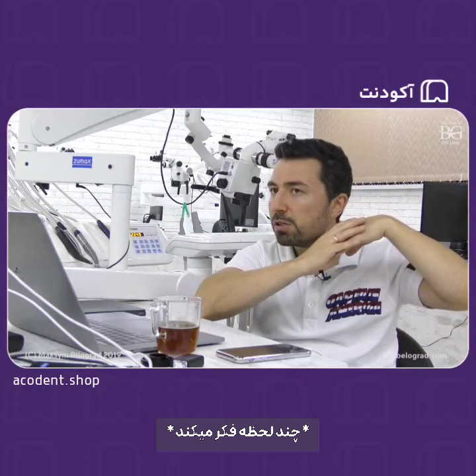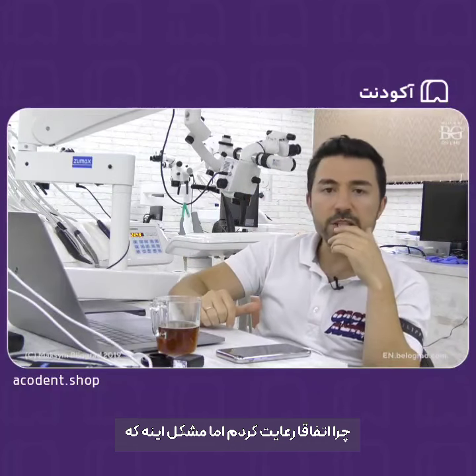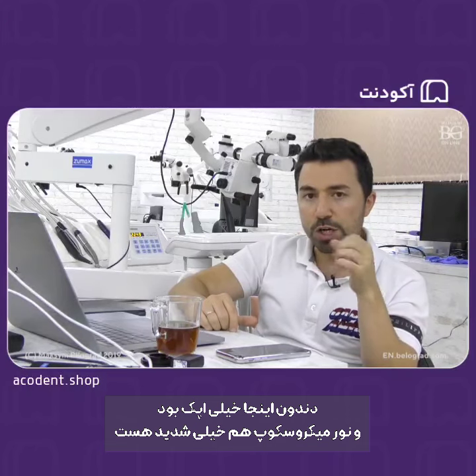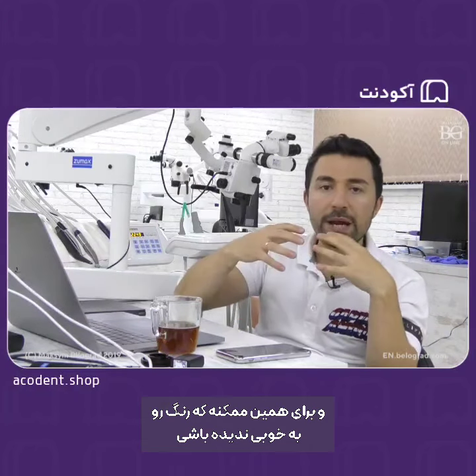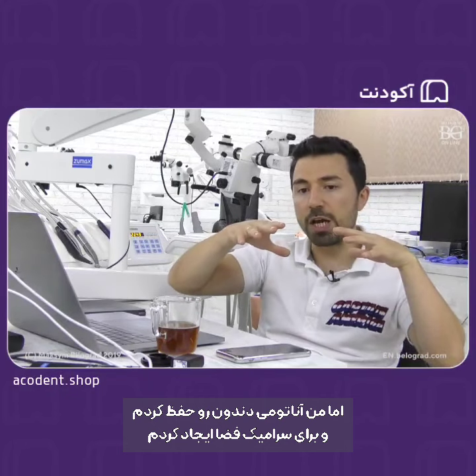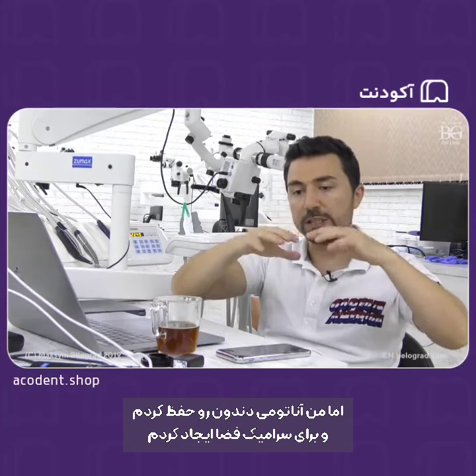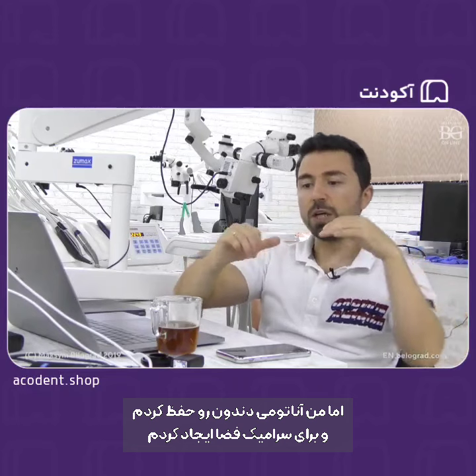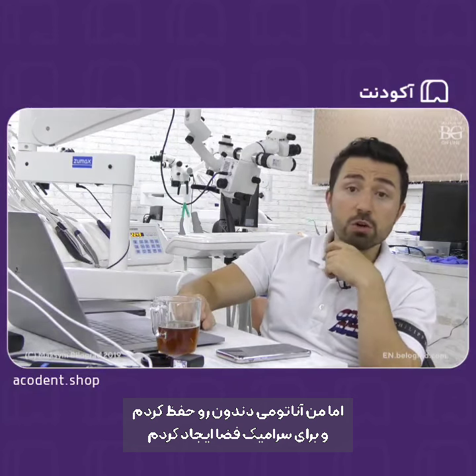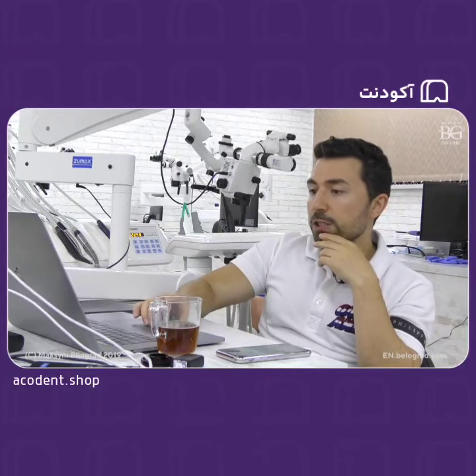Actually, this is a nice question. I think there was, because the problem here is that the tooth is opaque and the light source from the microscope is pretty intensive, so you may not see all the volume. But I keep the native anatomy. I create equal space for ceramic, and I keep the anatomical surfaces of teeth. This is what we do. Okay, good.